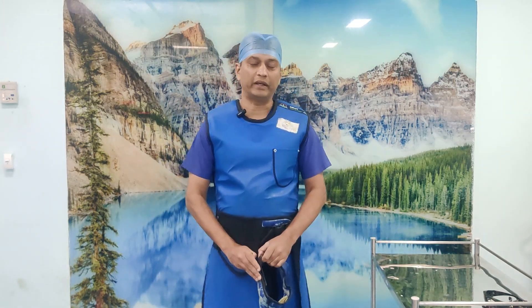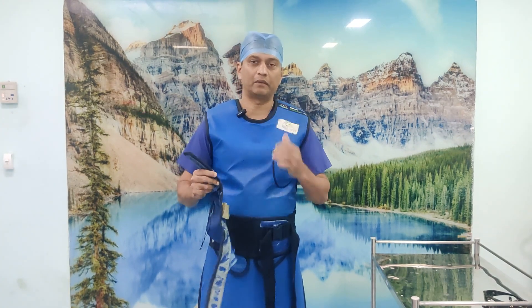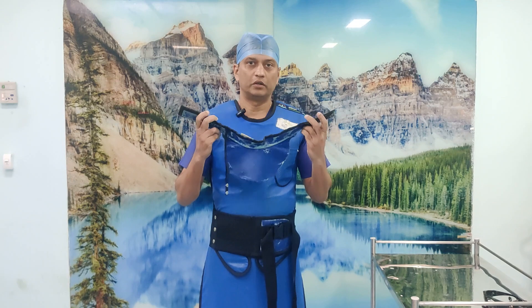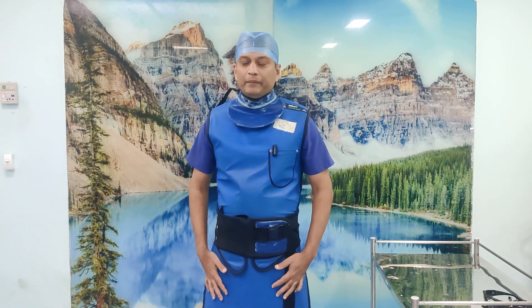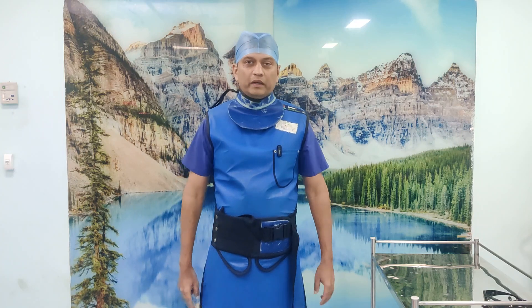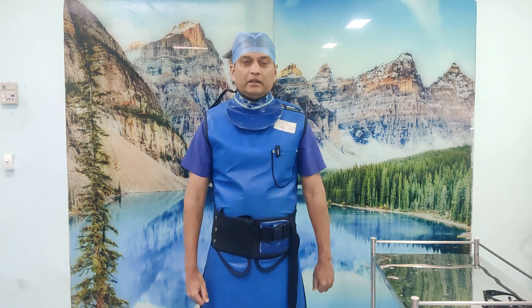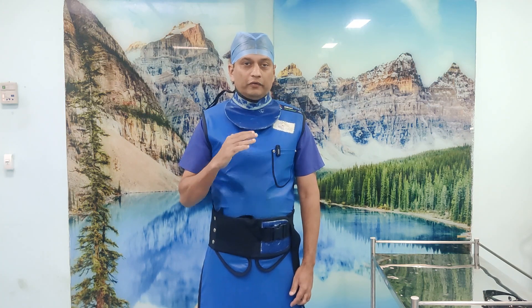If you want to protect yourself properly, you also need to wear the thyroid shield. Two common things which affect people who work in radiation are pre-senile cataract - early cataract at an early age - and second is thyroid cancer. So if you are doing trauma surgeries, buy this shield. If you are doing trauma surgeries without this, then you are doing it all wrong and putting yourself and your family in danger.